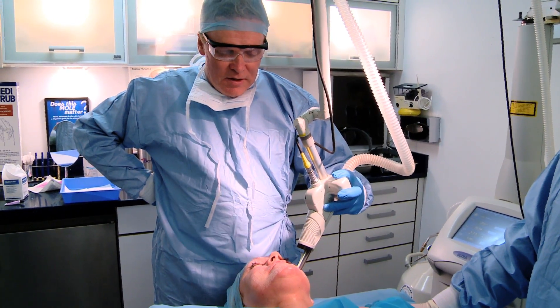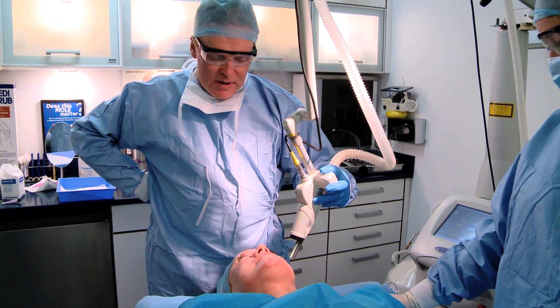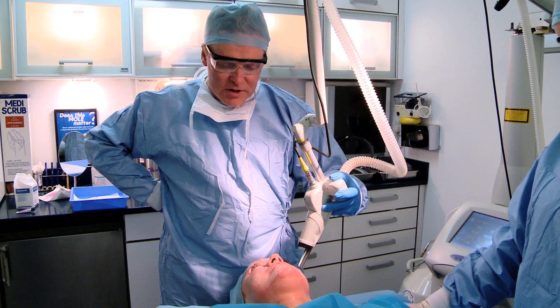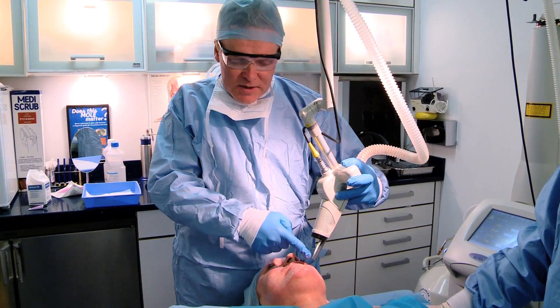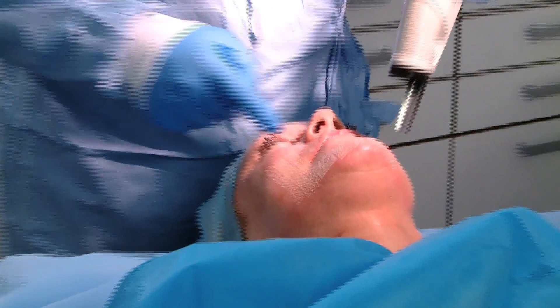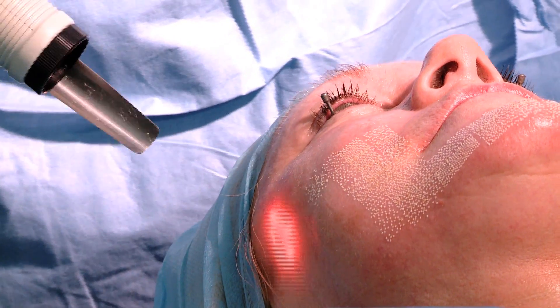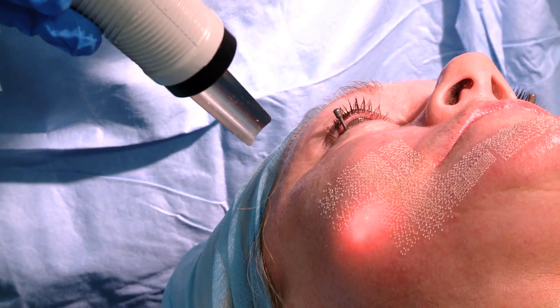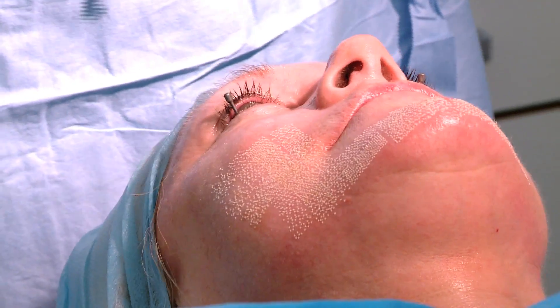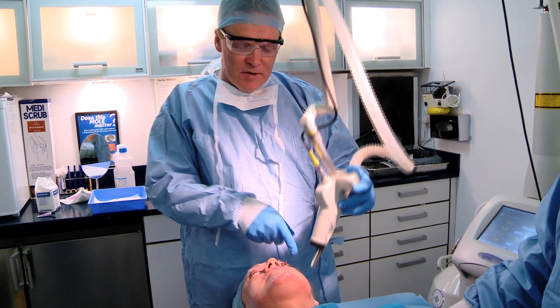If we pull the machine back, we get less power, so it's nice to individually titrate the machine. The maximum effect is when the little metal tip is actually touching the skin. We also know that if we fire it at an angle it produces uneven power distribution in certain areas. If we pull the machine off the skin we'll have less pain for the patient but also less effect. If we can keep it perpendicular and in contact, that is always preferable — that is the way the machine is designed to work.